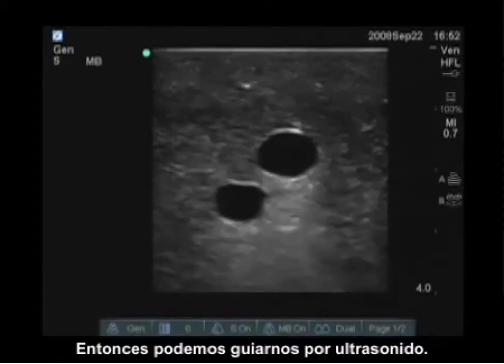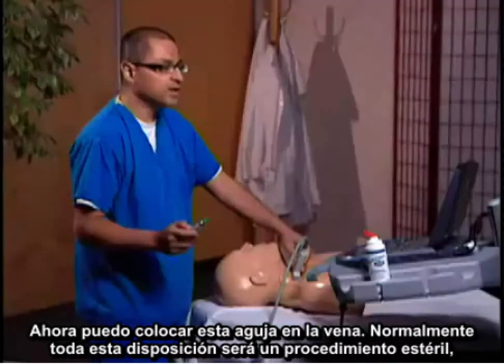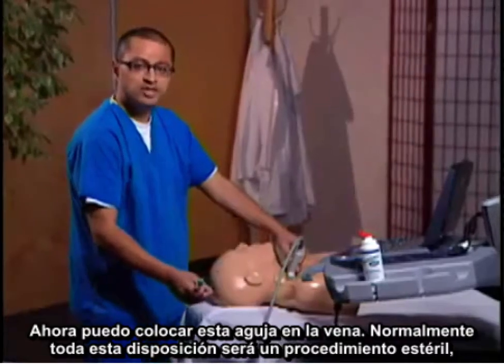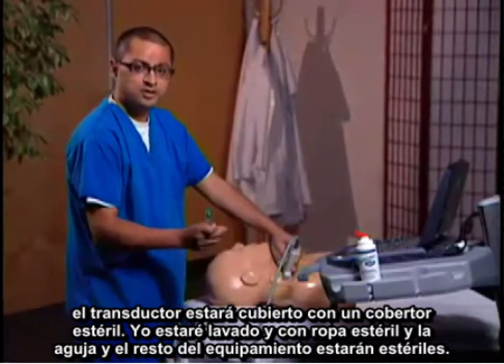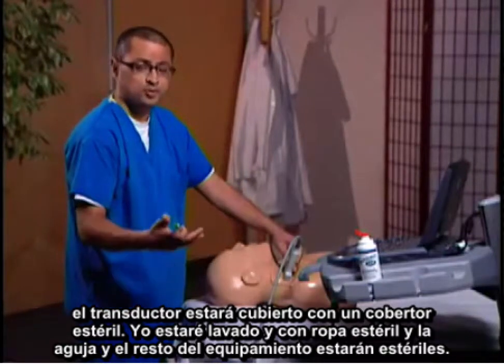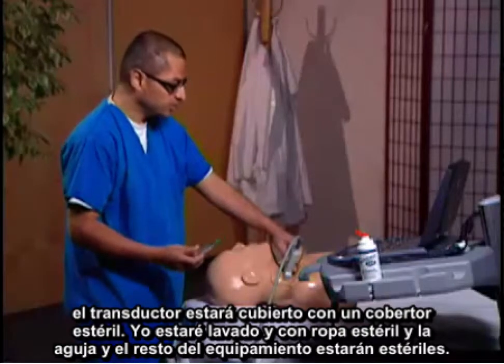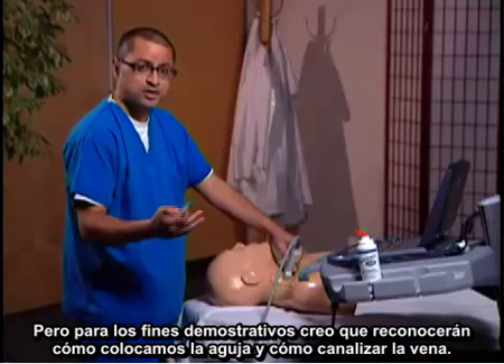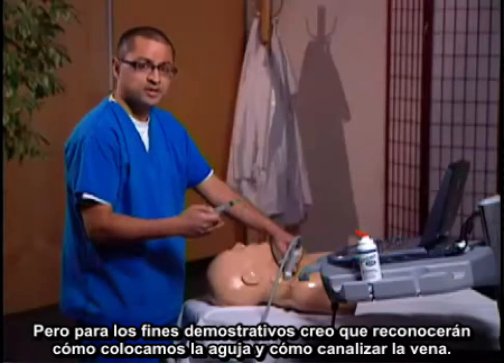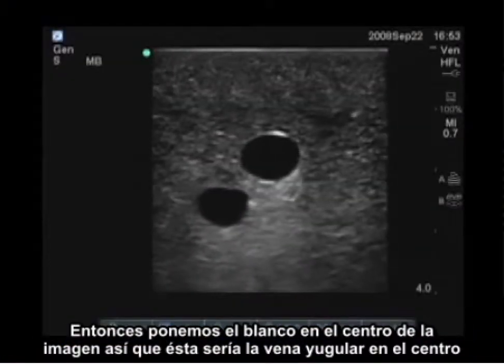So I can use ultrasound guidance. I can now place this needle into the vein. Normally this whole setup will be under a sterile procedure. The transducer will be covered with a sterile sheath. I will be in full sterile prep, and the needle and the rest of the equipment will all be sterile. But for the purposes of this demonstration, I think you'll recognize how I'm placing the needle and how we're cannulating the vein. So I put the target in the center of the image.